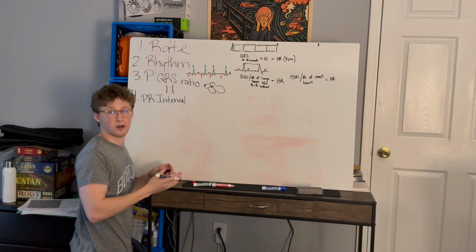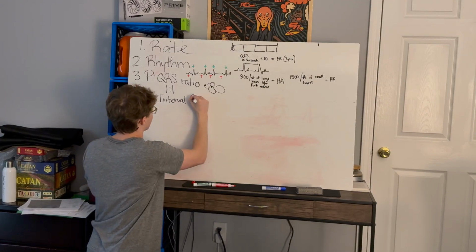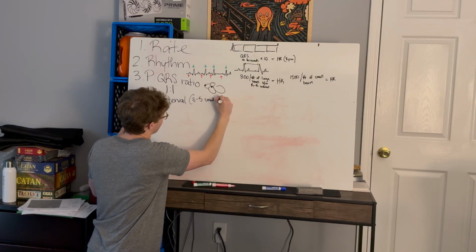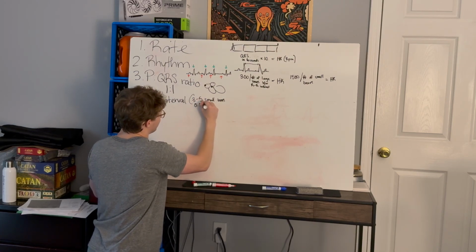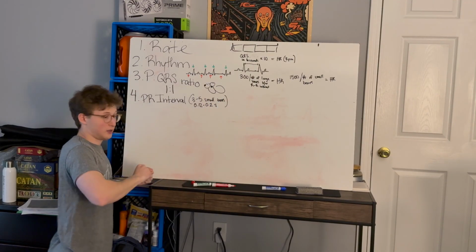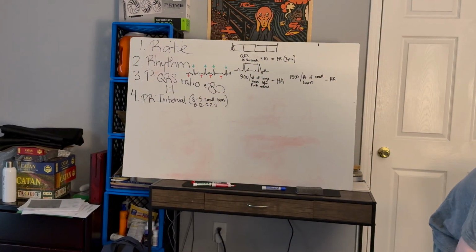Remember, what did we say it was? 3 to 5 small boxes, or it is 0.12 to 0.2 seconds. You know what? I better check it myself. Let's make sure I know that.